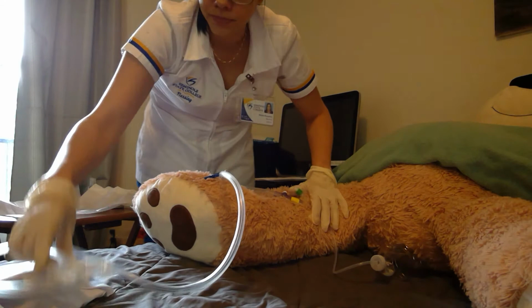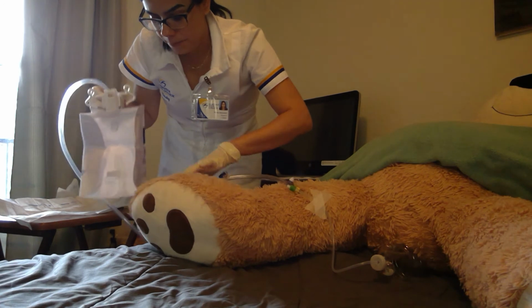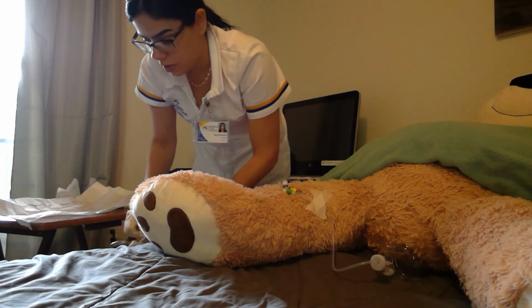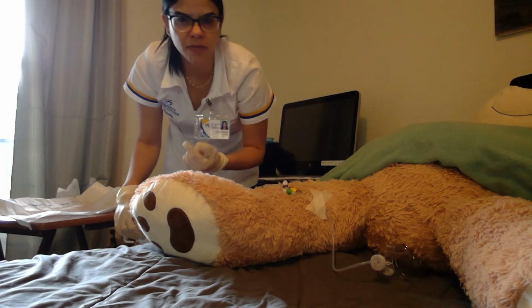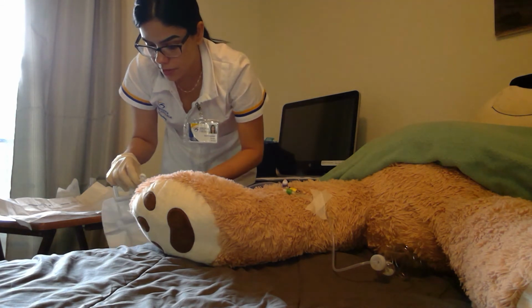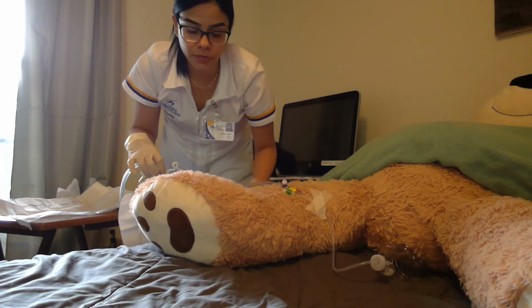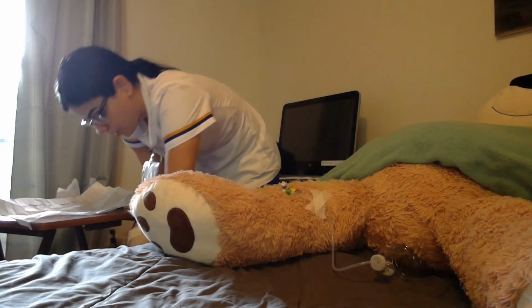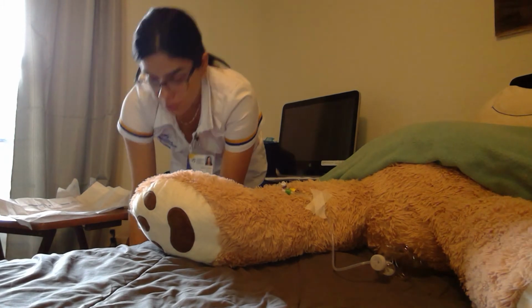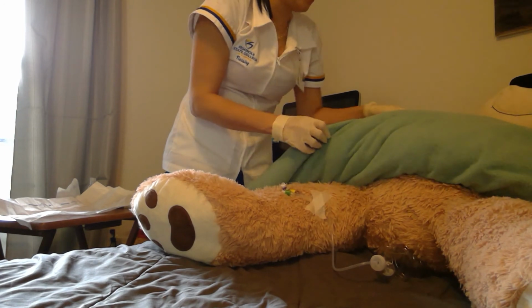Once I've done that, I got my Foley, and it is very important to position your Foley bag below the patient's bladder, so somewhere on the bed. Hospital beds, the frame, they have hooks and stuff that it is very easy to attach this to. The most important thing that you need to know is that this has to go on a non-movable part of the bed. So you don't want to put it on the bed rail, just want to put it maybe on the frame, and always below the patient's bladder. So once we've done that, we can just cover our patient again.